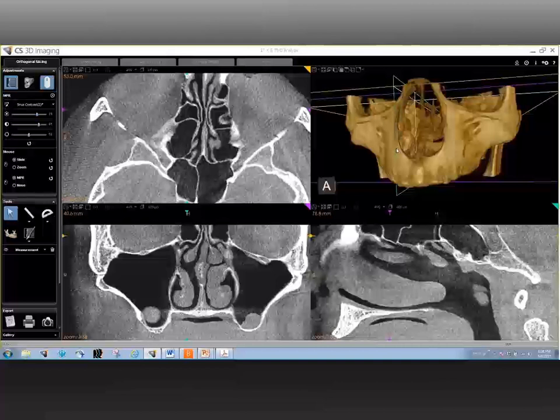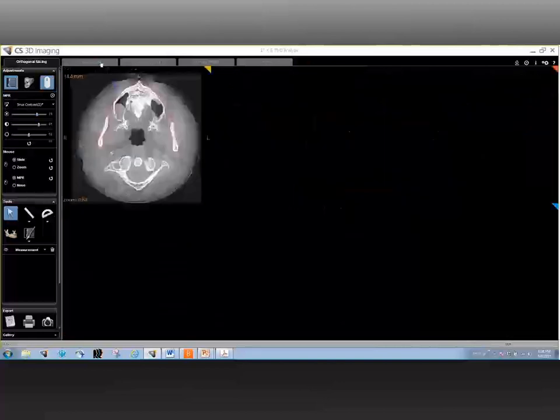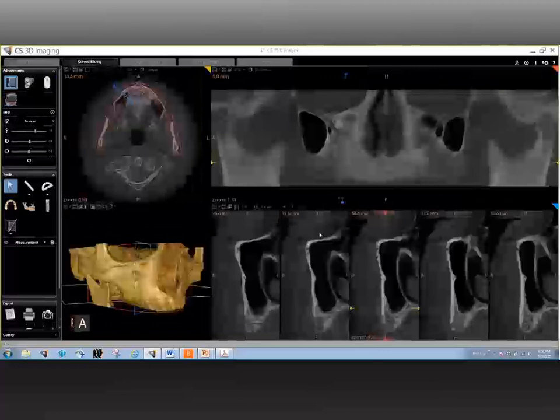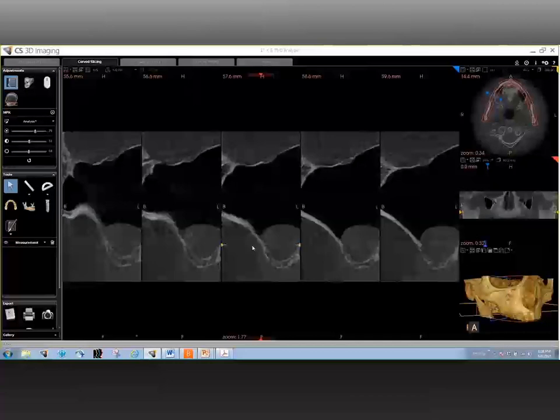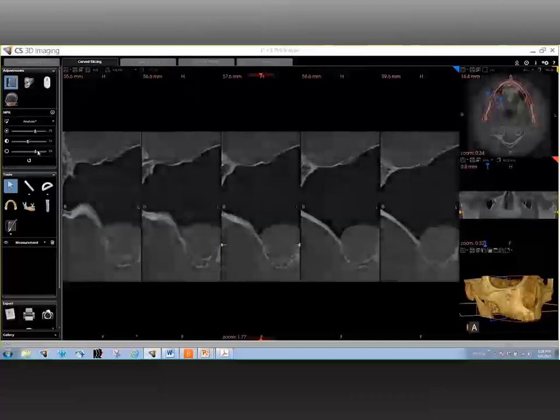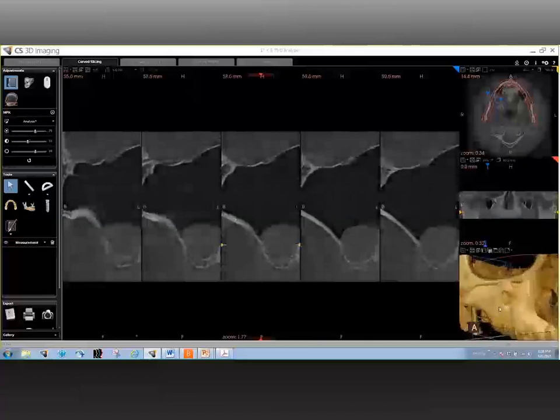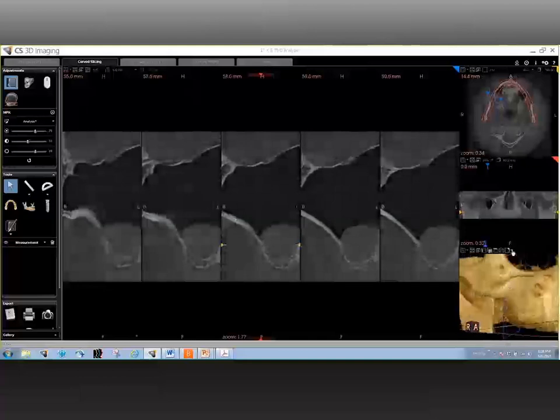Let me get back to what we were on. It's important to point out not just the benefits of cone beam CT but also some of the limitations. But let's go back into the subject — what are the most important landmarks to be considered while planning for implant surgery in the maxillary jaw? If you look at the cross-sectionals, going back all the way to the posterior area, using the traditional way of interpretation — the cross-sectional is one of the most important sections you would use for implant surgery. These shots show the cross-sectional view of the crestal ridge of the jaws, giving you the buccal-lingual aspect, which is a third dimension that is missing in a two-dimensional radiograph.